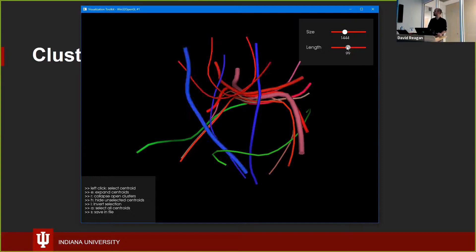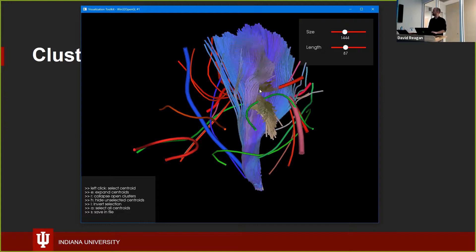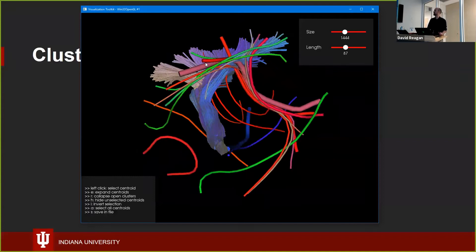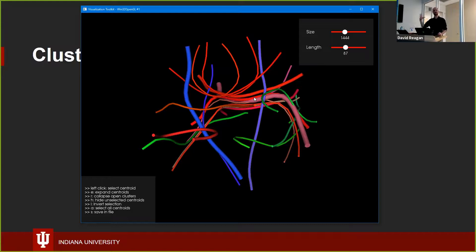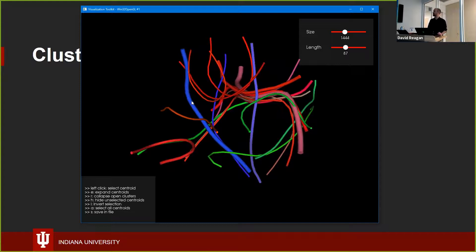I can select one — say this purple one — and if I hit the E key I can expand it and show the actual tracks that the model has gleaned from the underlying data. What we were showing before was just the centroid of that track. This is an attempt to abstract away the very dense clusters of white matter and show just the individual centroids, but you can expand them on demand. I can also select multiples.